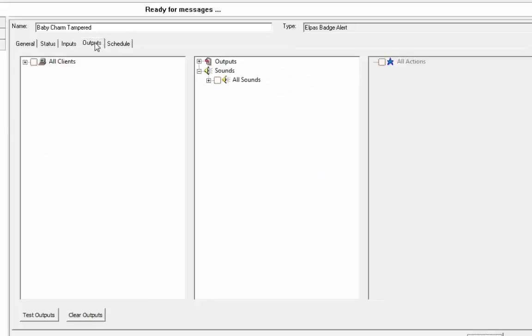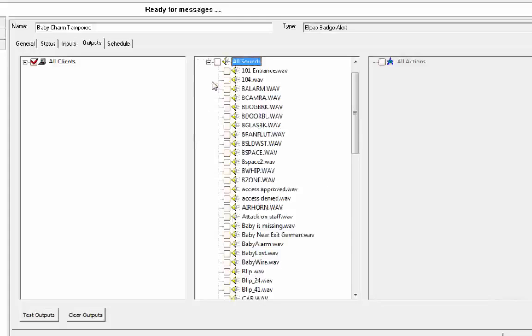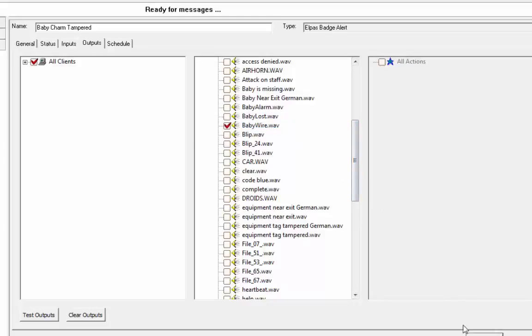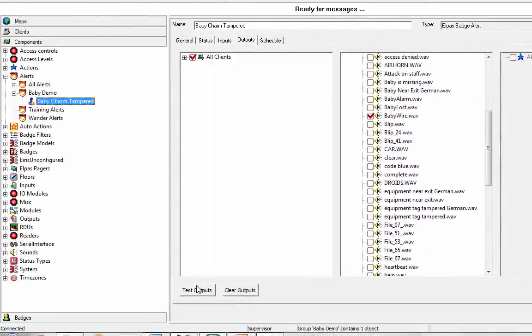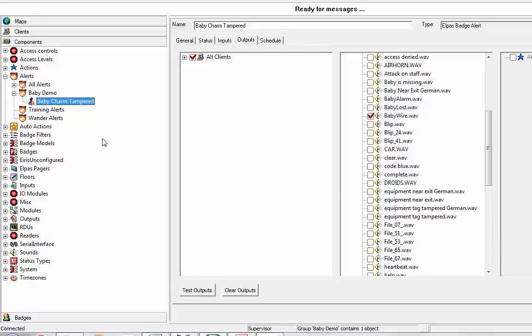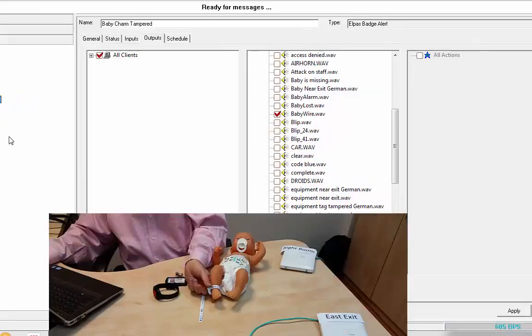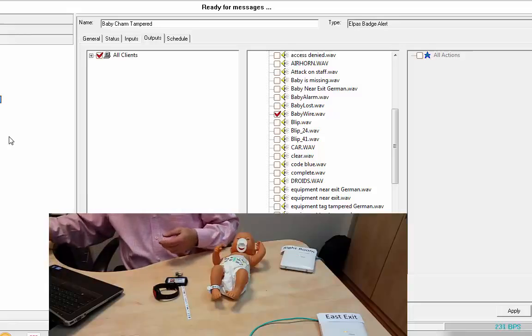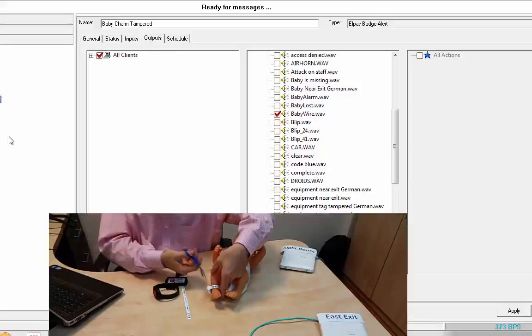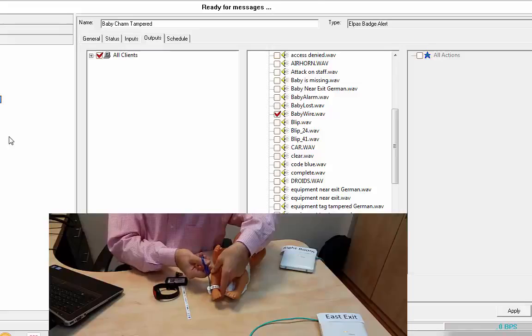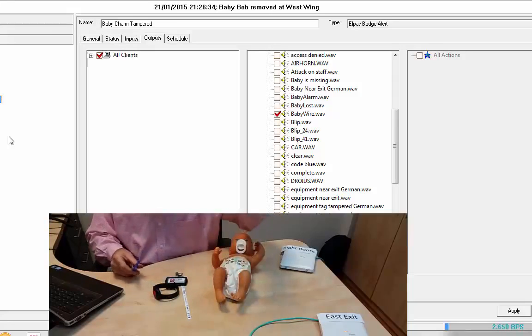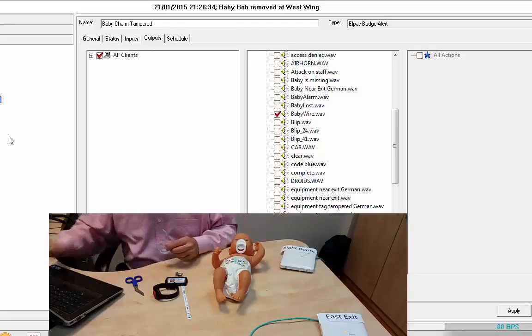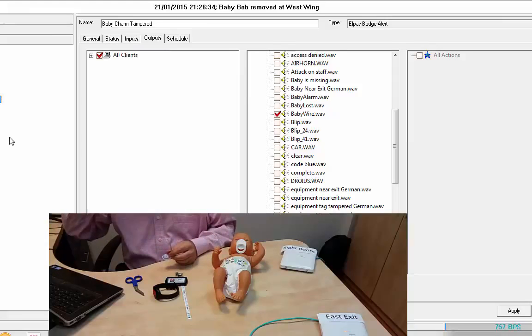We're going to automatically clear that after 30 seconds, just for our own housekeeping. On the outputs, we're going to do all clients, so do we see it on our client machine? And for the sound, we're going to give it baby wire, which happens to be a pre-recorded sound. I can test my outputs, and I get that baby tag tampered alert. So essentially if I cut the band here, I'm going to get that alarm. Might as well do it. We'll do it again with the Wander patient. I tag it. Baby tag tampered. There we go. So I cut the band, and I got the alarm.